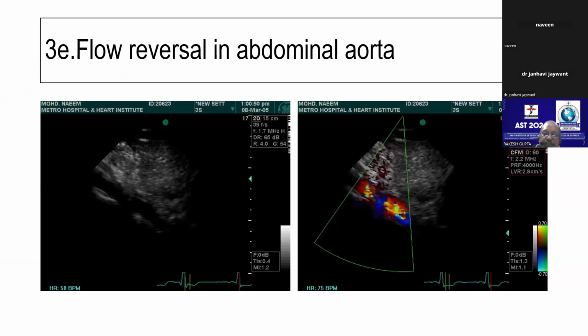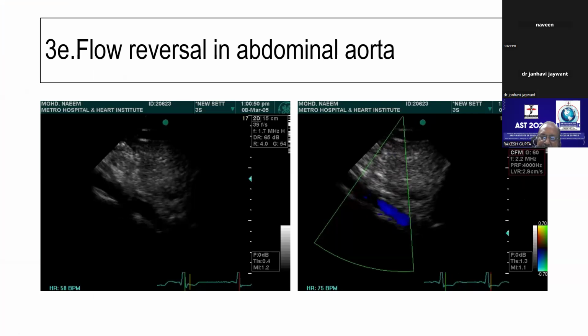The question comes when we have to decide between progressive and severe, meaning medical versus interventional. As soon as you see my vena contracta, which is 0.4, half of my things are decided already. In those cases, I take all parameters, and ultimately I know the LV is not dilated, my vena contracta is only 0.4, and my jet width to LVOT height is only 30-40%. So I will not be spending much time on that patient.